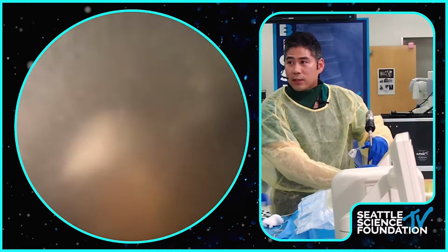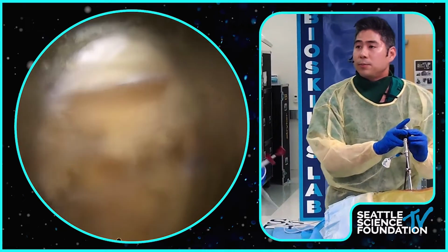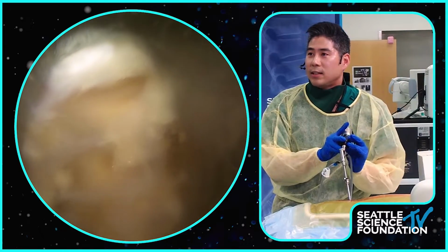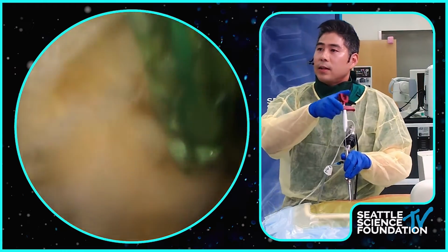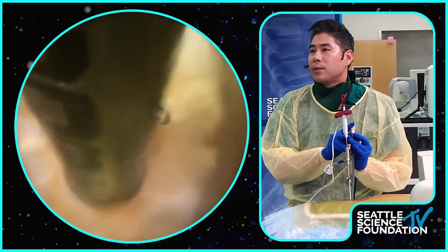So at this point, I stick the scope in. Let me see the bipolar. I wish I had this 55-inch screen in my hospital. This is really nice. So usually there is some soft tissue and stuff like that. I can clean this up. And Steve, could you help me with the focus?